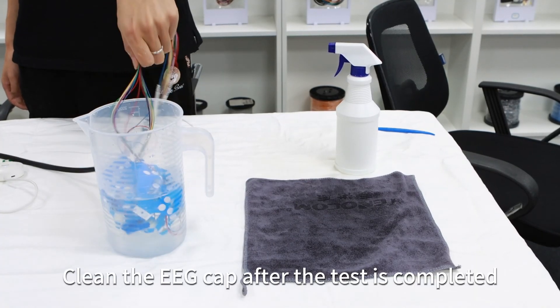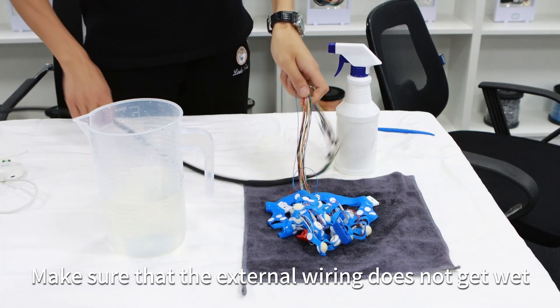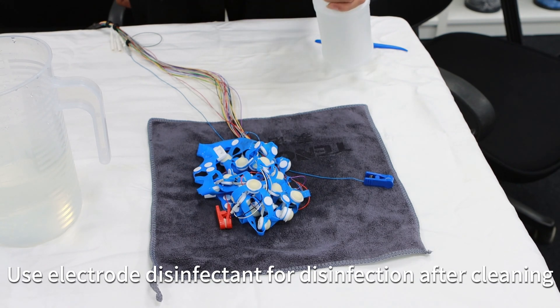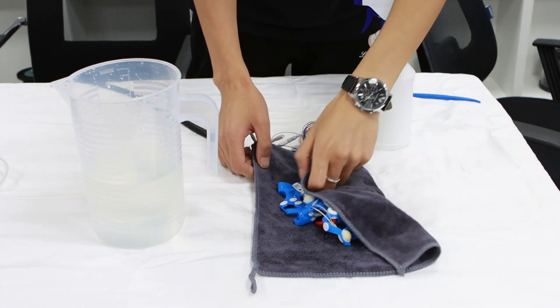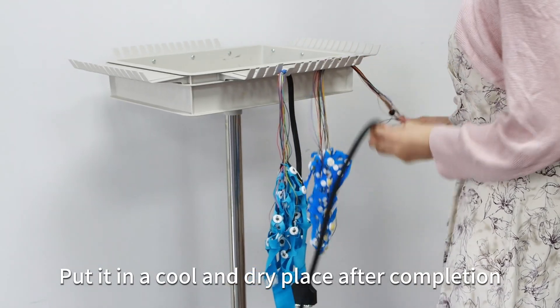Clean the EEG cap after the test is completed. Make sure that the external wiring does not get wet. Use electro disinfectant for disinfection after cleaning. Then clean again and dry. Put it in a cool, dry place after use.